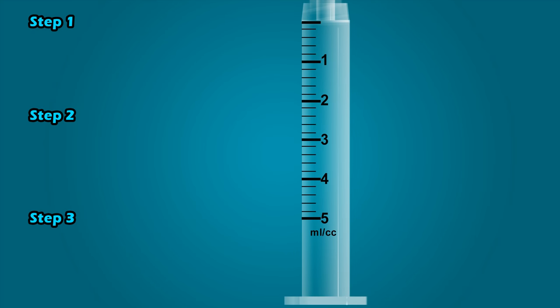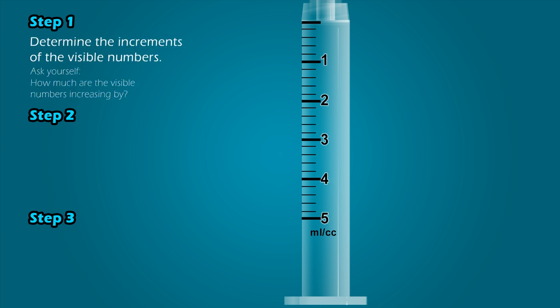Now let's focus on interpreting the values of the graduation marks on these syringes. To interpret the values of graduation marks, we will use a three-step process. Step 1: Determine the increments of the visible numbers. On this 5 mL syringe, this line represents 1 mL, this represents 2 mL, and so on. Therefore, the visible numbers are increasing in increments of 1.